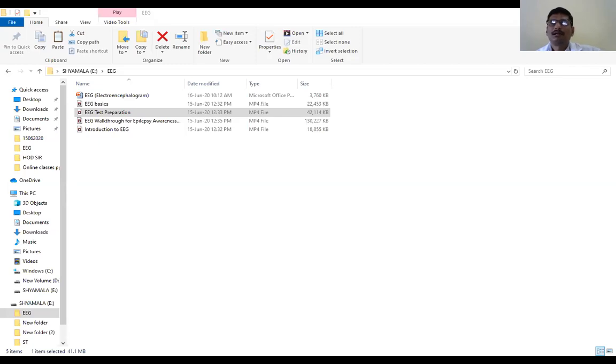Number one, by recording EEG, we can record a local maybe hematoma or edema in a particular area where EEG waves will be diminished, or will become low voltage, or it may show some spikes at a particular area, showing some epilepsy or epileptic foci, or sometimes it can also show certain brain lesions or tumor, etc., where abnormal delta waves can be seen whenever there is organic lesion in the brain. Or as I said, in the case of brain death, it doesn't show any spikes or any waves. Simply, that will be a very plain line, by which we can identify somebody is alive or brain dead.